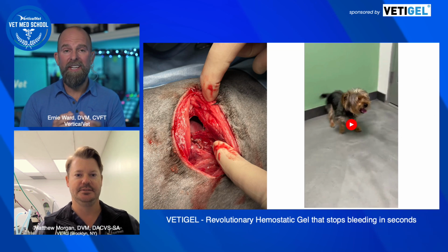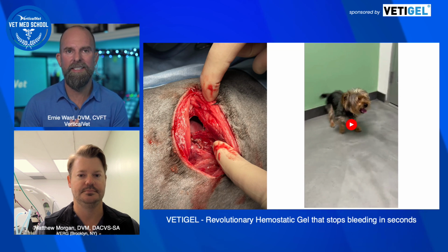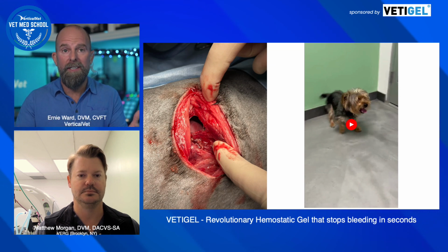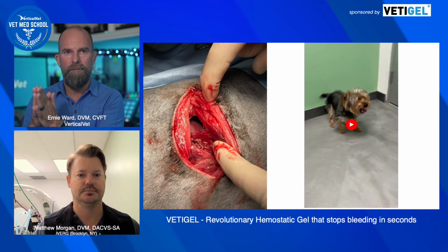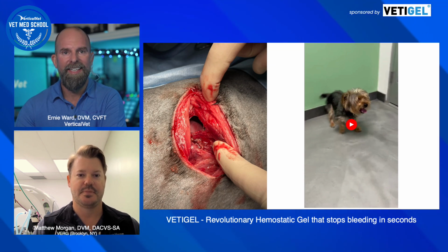That's just impressive. And I'll tell you, two things really jump out at me in a case like this. I think most of us, if you've been in practice for any length of time, you're going to see a trauma like this. The first thing, Matthew, A, you've got seconds, literally. And B, you can't visualize, you can't see what you're trying to do. Number one, it bought you a little bit of time, but more importantly, it bought you a visual field that you could work in. And that is remarkable, because I'm just thinking back in the day, it's just suction and sponging, and maybe not, right? Because they're bleeding out very rapidly. What a phenomenal case. Anything else you got?